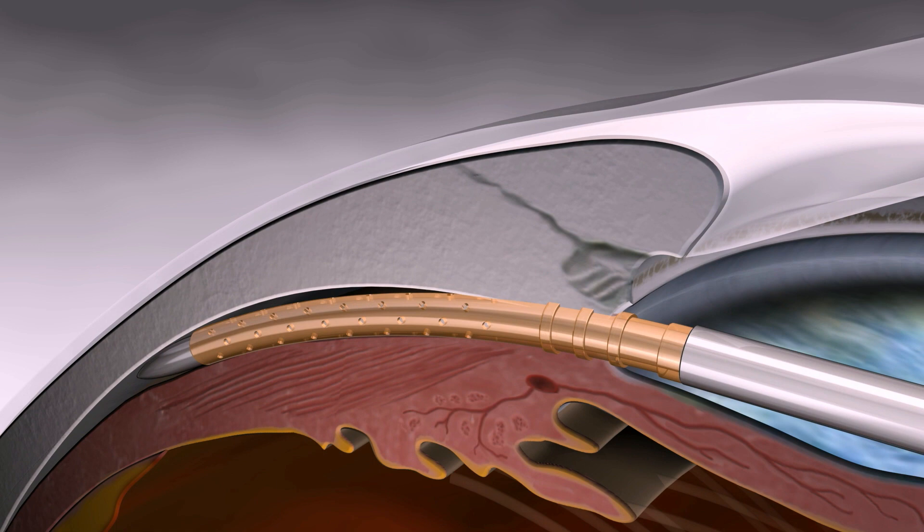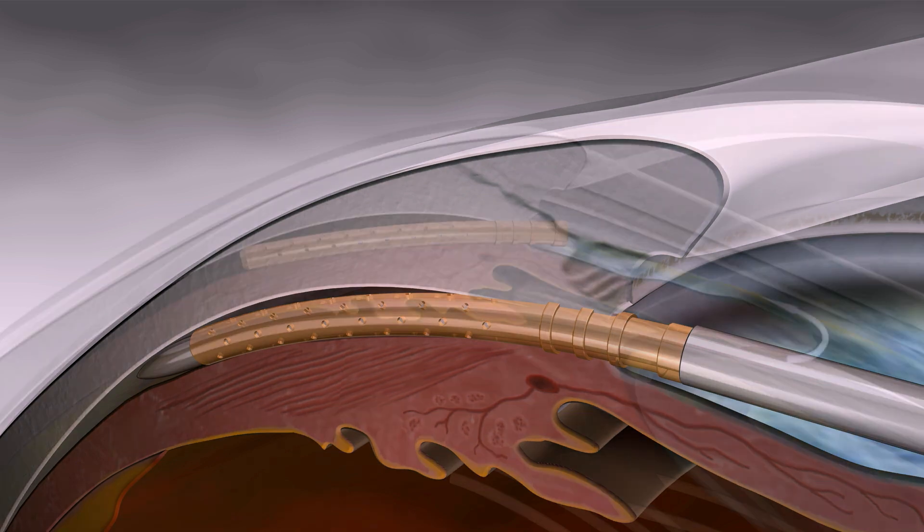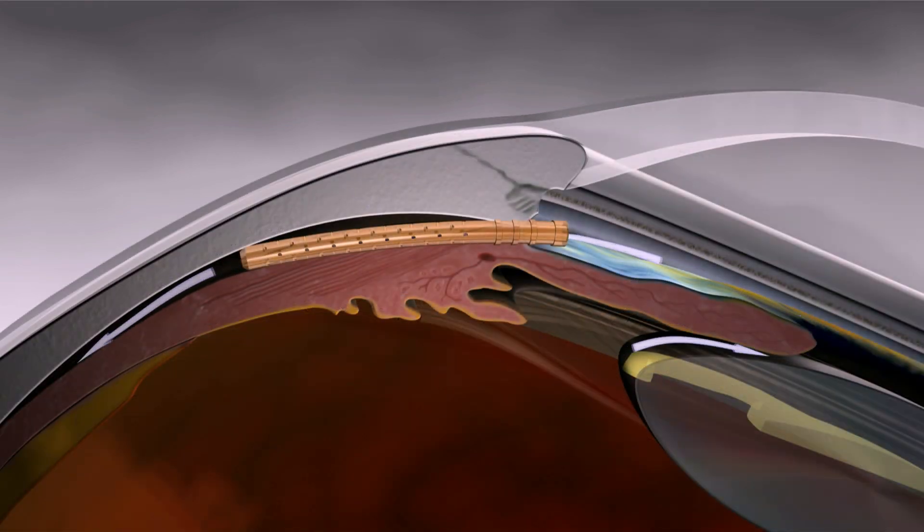Once the microstent is in its final desired implantation position, the guide wire is then retracted, and the Cypass Applier is removed from the anterior chamber.